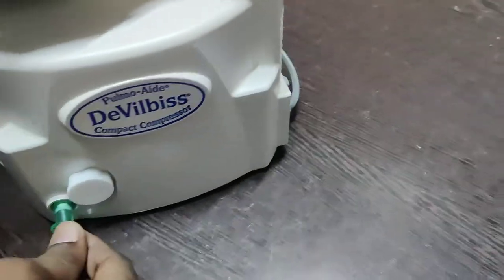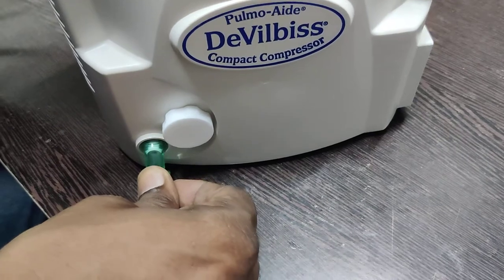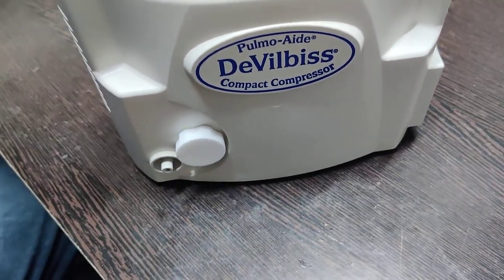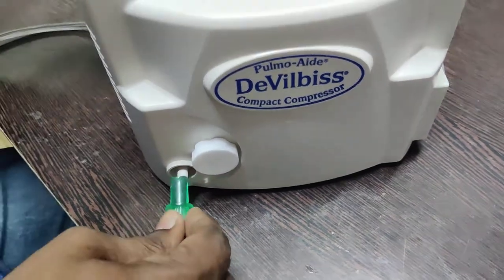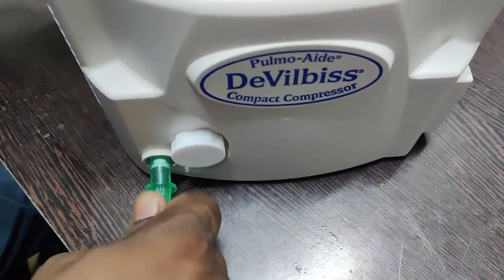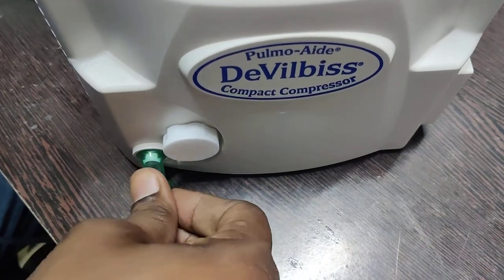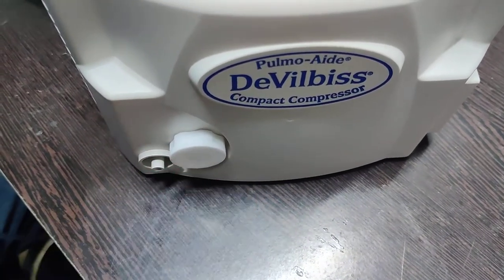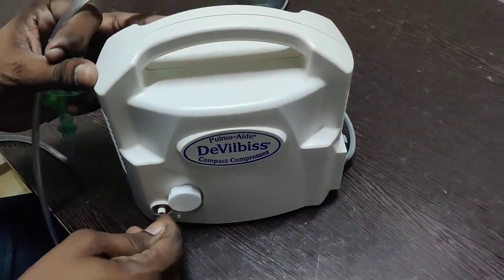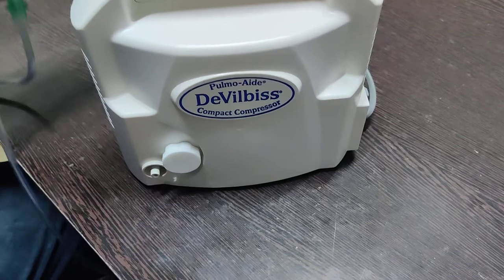The recommended way of removing the tubing is to slightly push it in first and then pull it out. To demonstrate again: don't pull the tubing directly — instead, push then pull. This way you are safeguarding the device and making sure you are not damaging the nozzle.